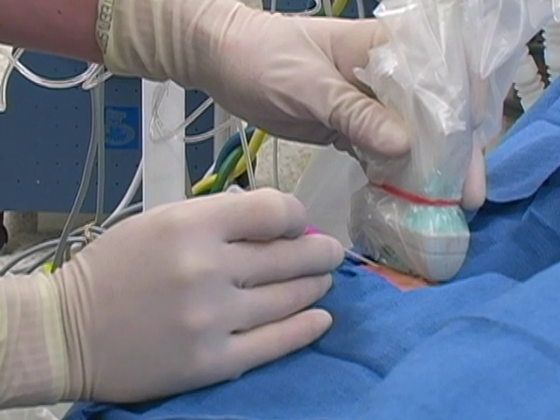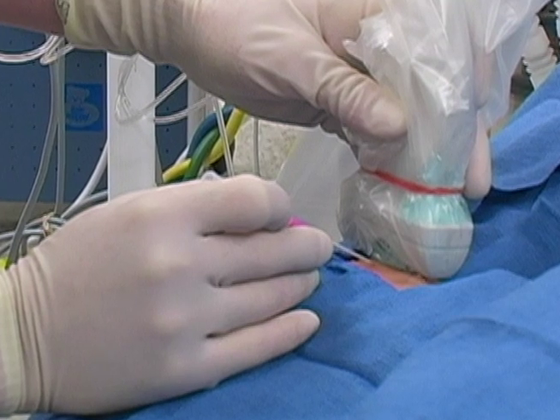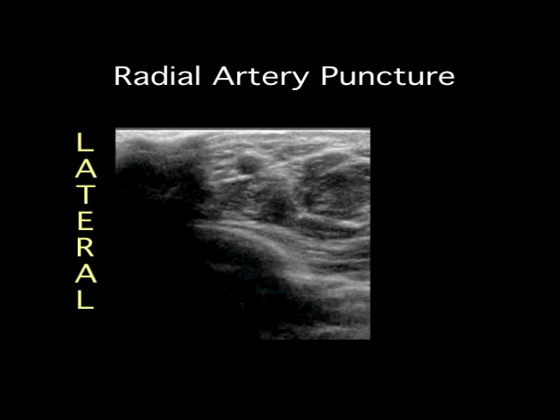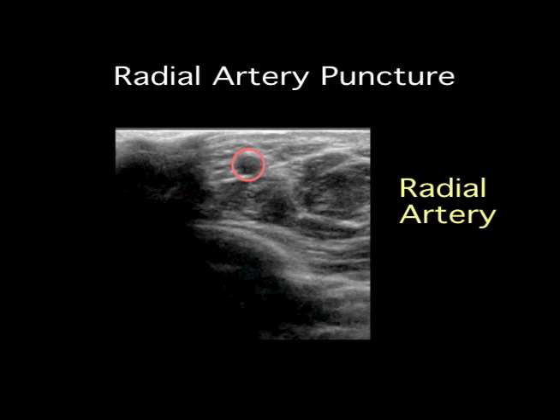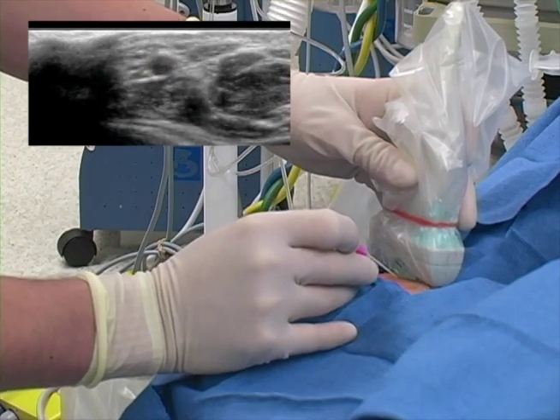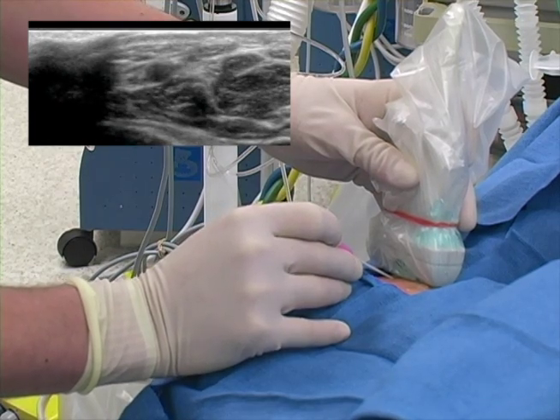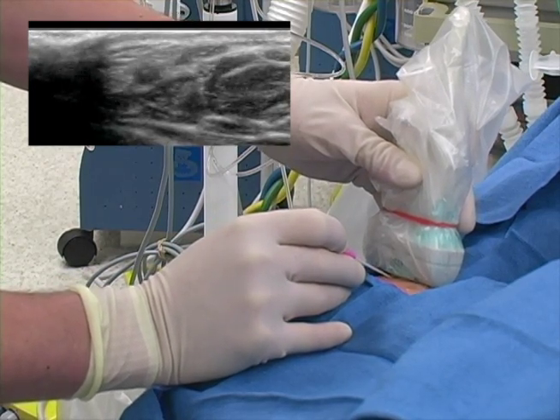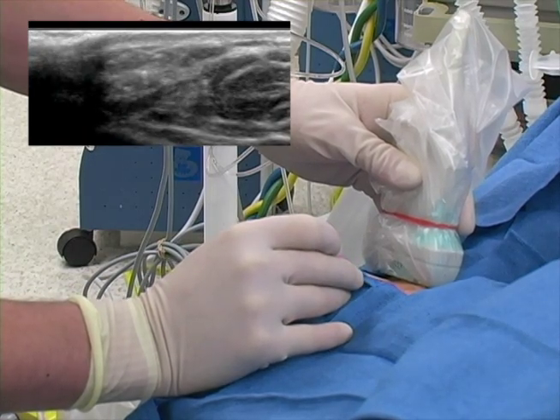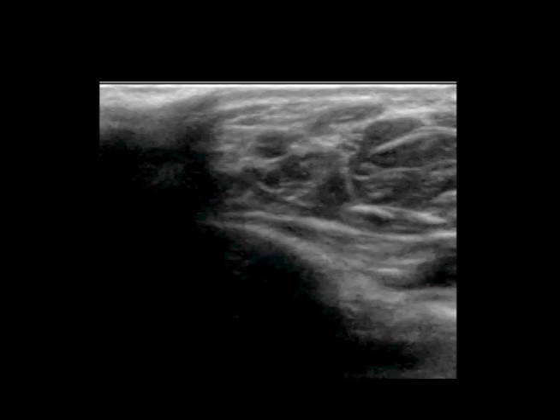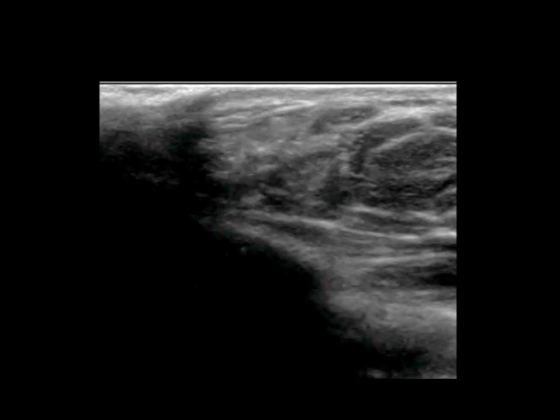Now let's take a look at the sonogram of the wrist that the operator will use to guide the arterial puncture. Lateral is on screen left, which corresponds with the operator's left. The radial artery is near the skin surface and is clearly pulsatile. The operator advances the needle, which is seen indenting the artery. Looking at the sonogram, we see the hyperechoic needle tip enter the artery, which corresponds with the flash of arterial blood.